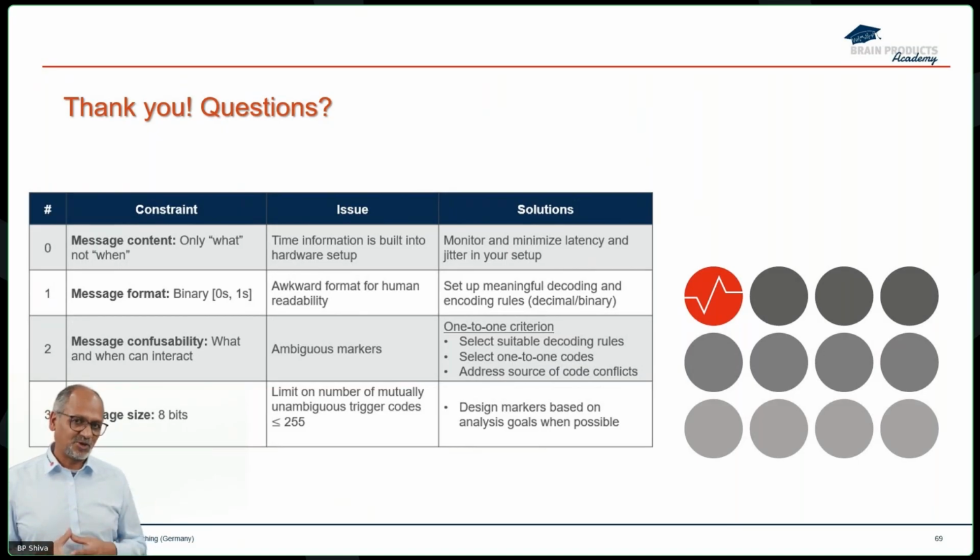Now, the trigger box, for example, uses a mixture of a serial and a parallel structure. For example, it uses a USB, which can have a very high data volume and can be very fast, in conjunction with a parallel port. But if you only use a COM port, you might expect complex latency issues. So David, maybe you have some thoughts on this question as well?